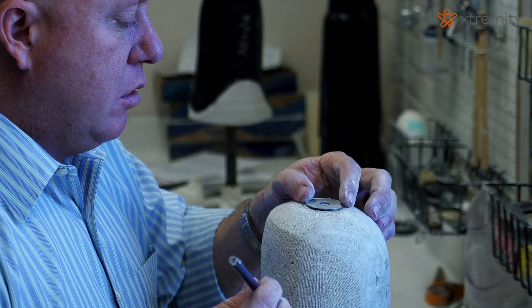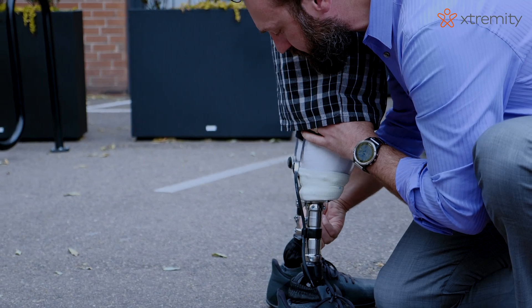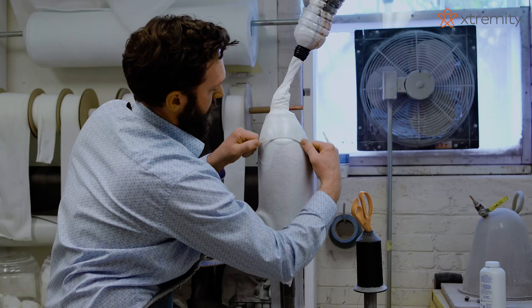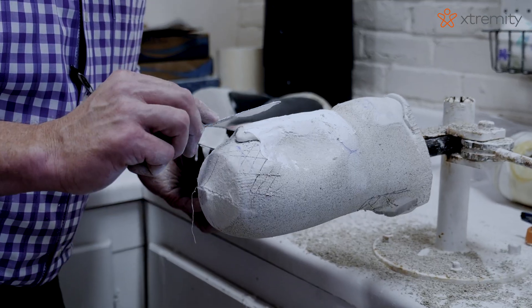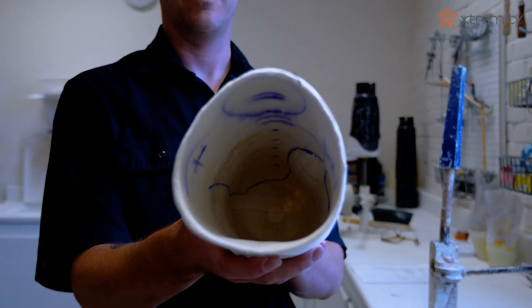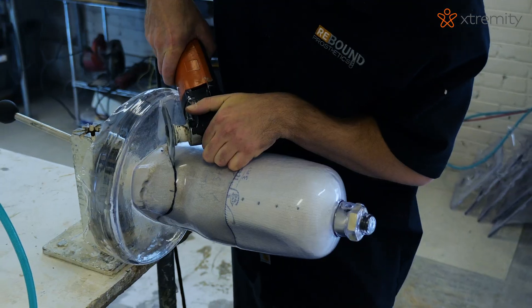I think prosthetists are ready for a change, but patients are even more looking for the next improvement in prosthetic socket design. In general, sockets have been built the same way for decades now. There's been virtually no change in the construction behind them and the ideas behind the fit. We've seen some changes in liners and suspension systems, but overall the sockets are very similar to what they were many, many years ago.